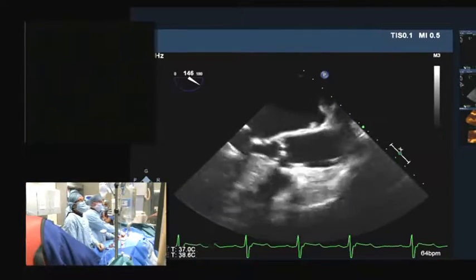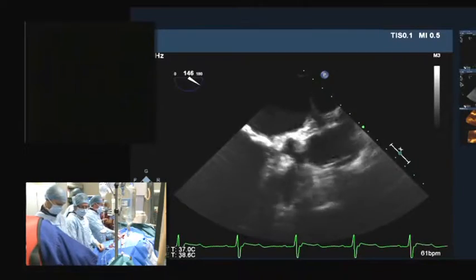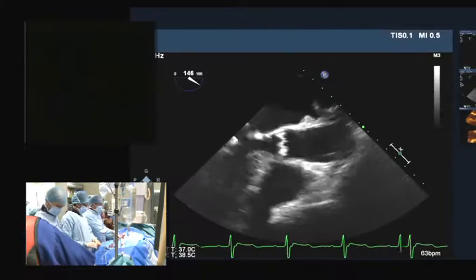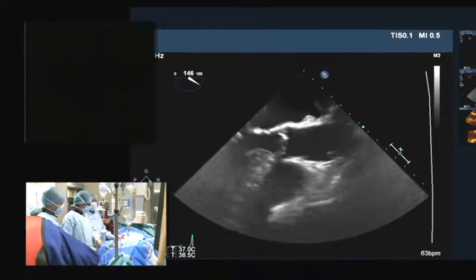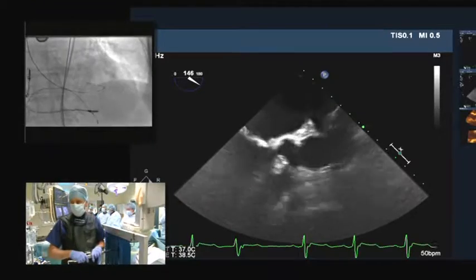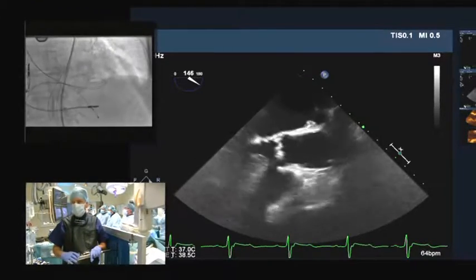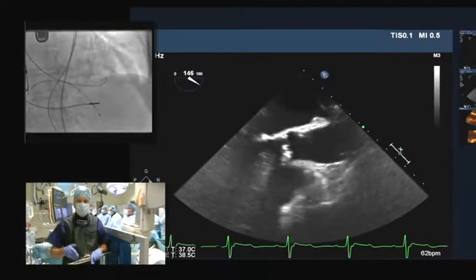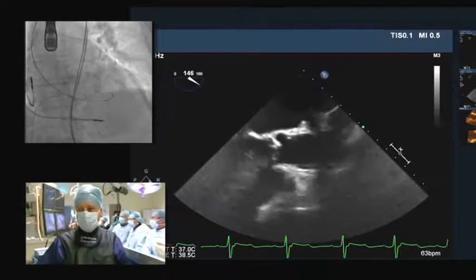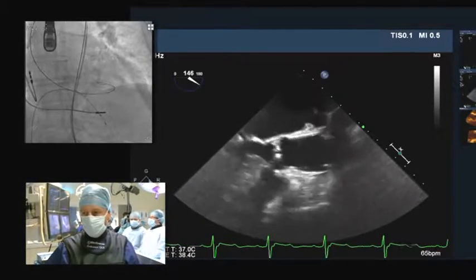So, Mark, the situation where we've got the wire in the ventricle and we're just about to do the balloon valve repositioning, we're just going to pause for 30 seconds because the valve isn't quite ready yet. We're going to be using a 20mm balloon. During the balloon valvuloplasty we'll use X-plane imaging, so we can look at the way the valve leaflets behave and how they fit into the sinuses as the balloon is inflated.